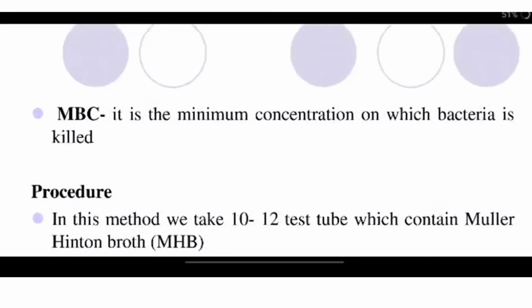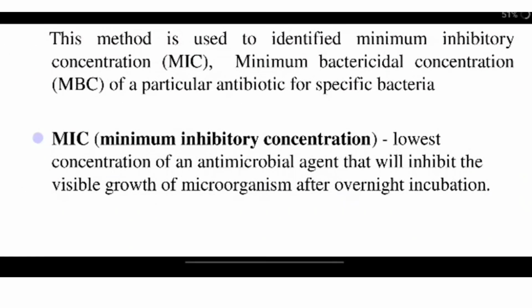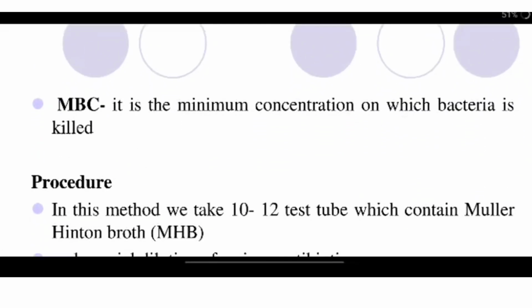MBC is the minimum concentration at which the bacteria is totally killed. So in MIC, we cannot see the growth, but that doesn't mean the bacteria is not present. It is able to stop its growth. And in MBC, it is able to kill the bacteria properly.